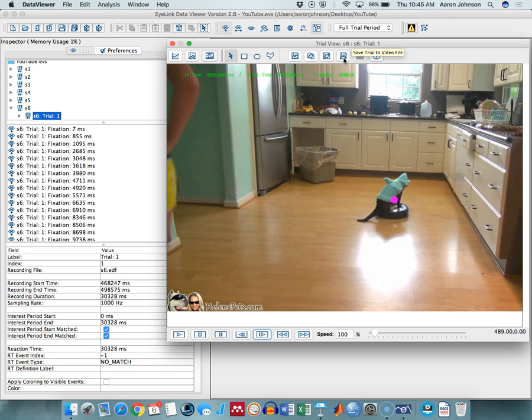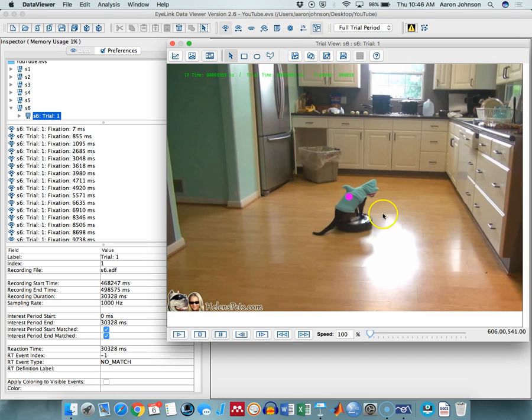Now, this is all very well and good, but say, for example, I now want to take an average of where the actual person was looking at in terms of an area of interest. So what I could actually do is, if I just scroll back here, I want to say, okay, well, you can see from the eye movements, they're kind of dancing around.